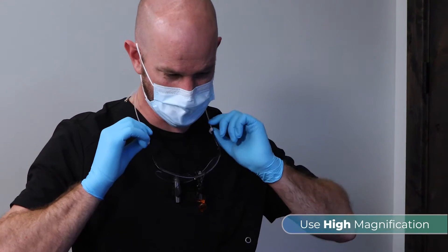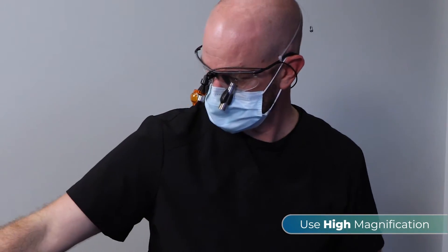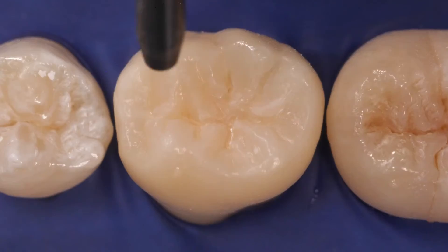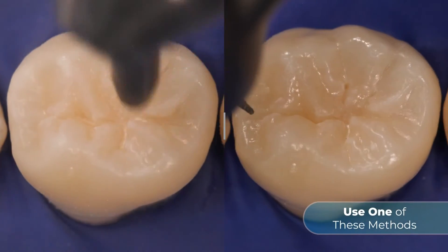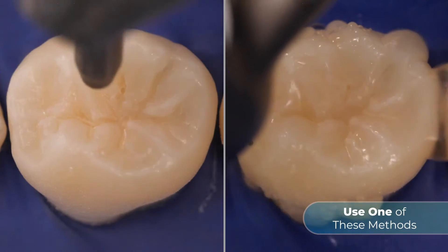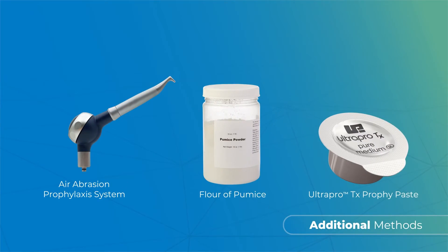To prepare the tooth prior to applying the sealant, use high magnification and one of the following methods: air abrasion with appropriate particles, a thin diamond fissure or prep burr, Consepsis scrub slurry, or one of these additional methods.